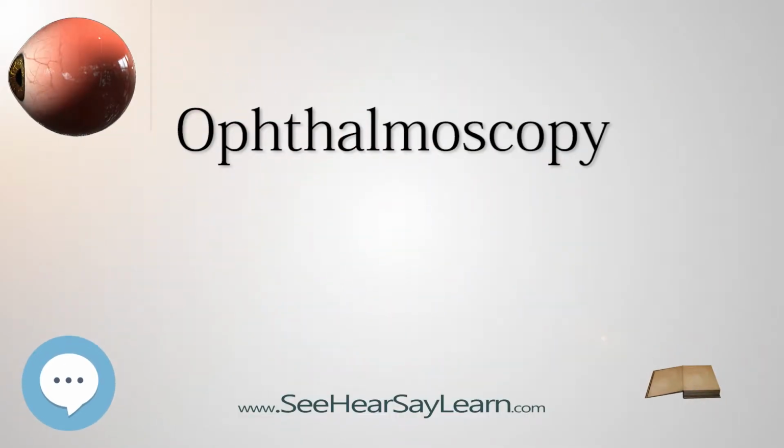Ophthalmoscopy, also called funduscopy, is a test that allows a health professional to see inside the fundus of the eye and other structures using an ophthalmoscope, or funduscope. It is done as part of an eye examination and may be done as part of a routine physical examination. It is crucial in determining the health of the retina, optic disc, and vitreous humor.